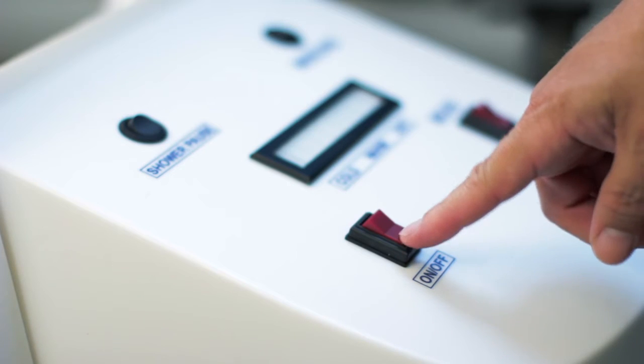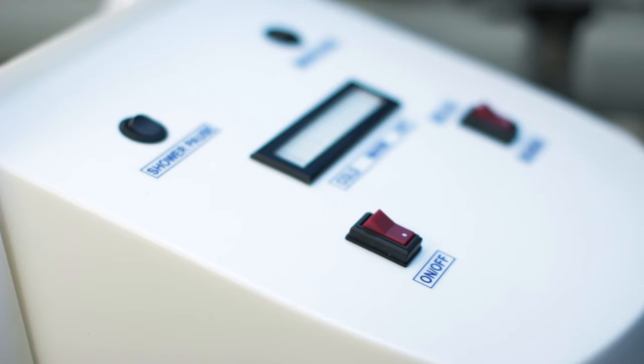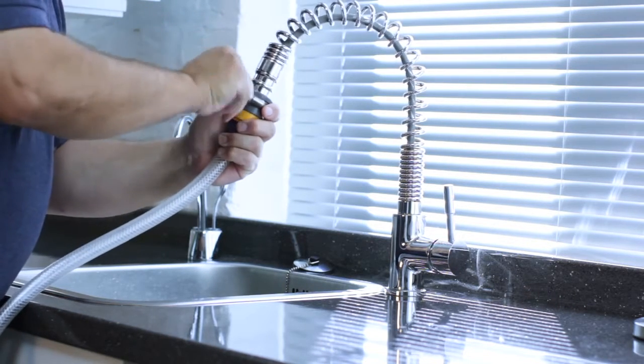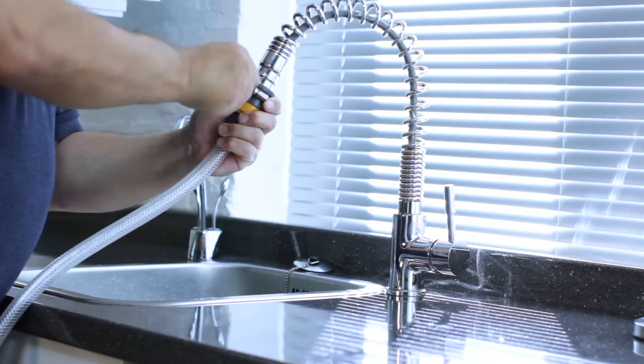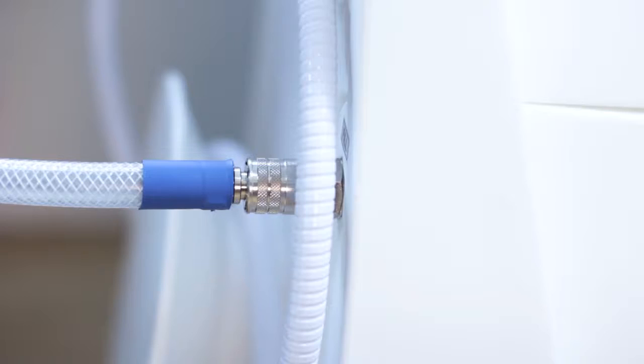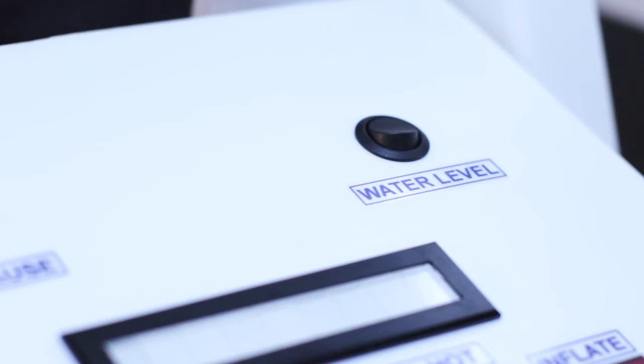Switch on the Watergenie. A bleep will sound letting you know the system is responding. The Watergenie is supplied with a choice of fittings — find the correct one and connect it to the taps. Push the other end of the filling hose into the silver connector on the back of the Watergenie.